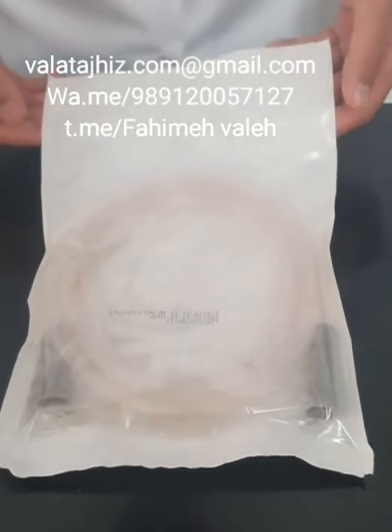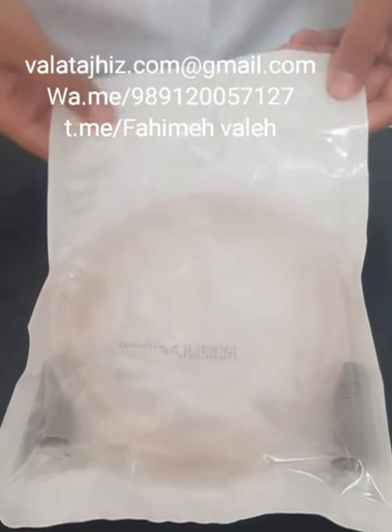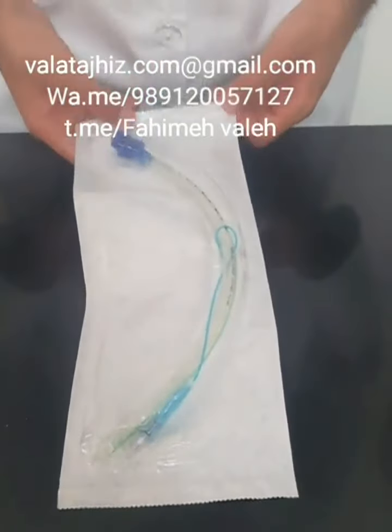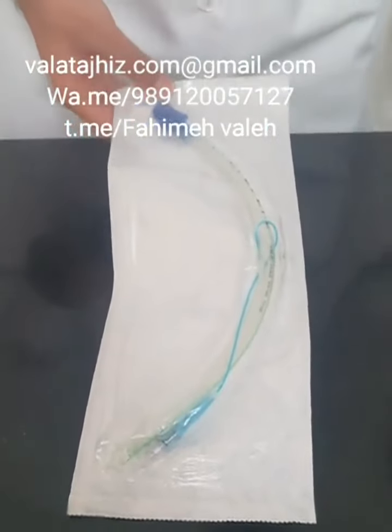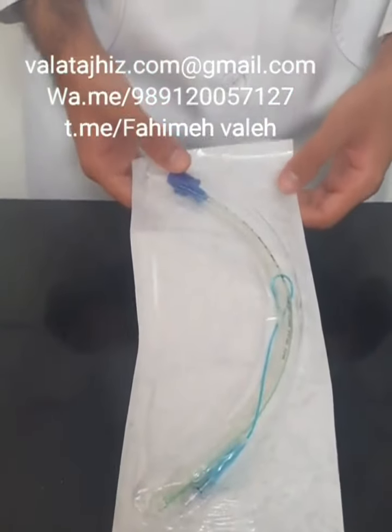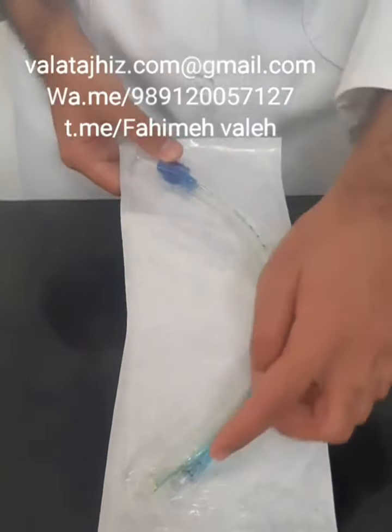This one is a sterile suction tube and it's just for single use — after using it, it must be destroyed. This is a cuff tube. It is used to deliver high concentration oxygen to people with breathing problems. You can also buy it without the cuff.